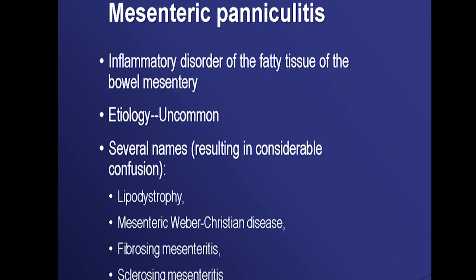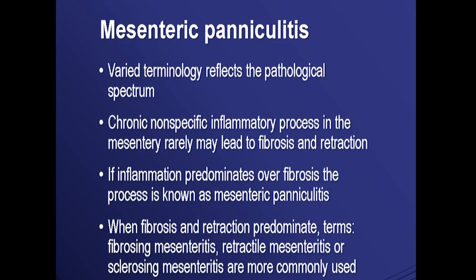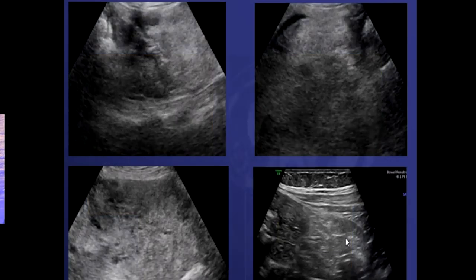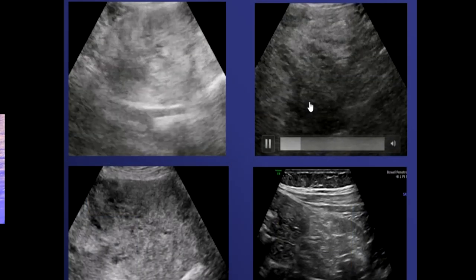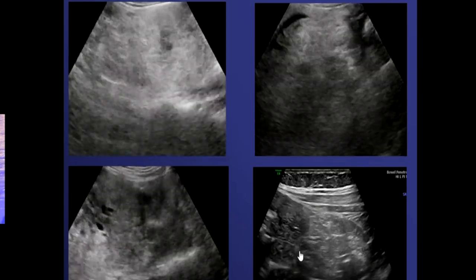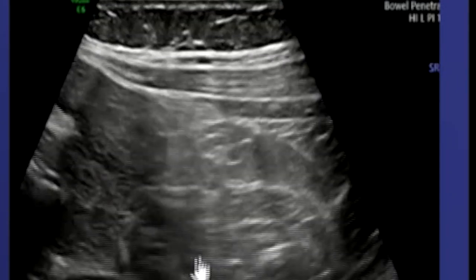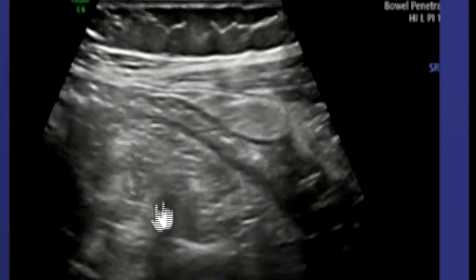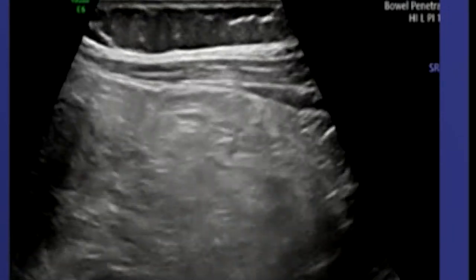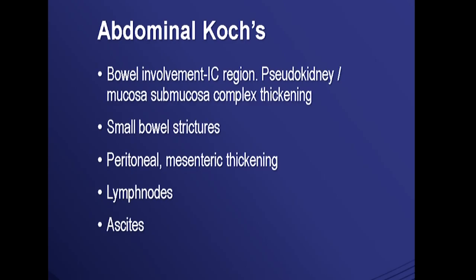Mesenteric paniculitis is a chronic non-specific inflammatory process in the mesentery that may lead to fibrosis and retraction. When fibrosis and retraction predominate it is called fibrosing mesenteritis; when inflammation predominates it is called mesenteric paniculitis. On high-frequency ultrasound you see thickened, heterogeneous-looking mesentery with fat deposits. When fibrosis and retraction predominate it is called retractile paniculitis. Bowel loops are seen pressing through it, and CT is suggested.